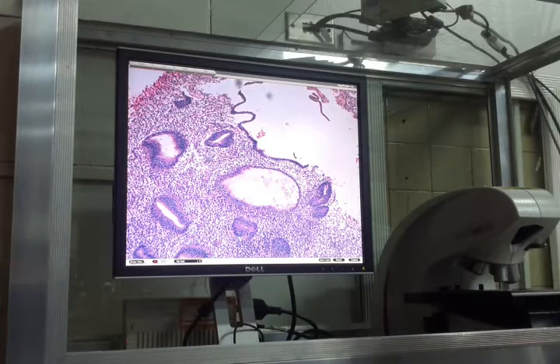Okay? Do you still remember the Swiss cheese appearance? Yung Swiss cheese appearance, yung kinakagat na mga daga sa cartoons. Butas-butas yung Swiss cheese. Okay. Kaya tinatawag dito Swiss cheese appearance kasi malalaki yung cystically dilated yung glands mo.